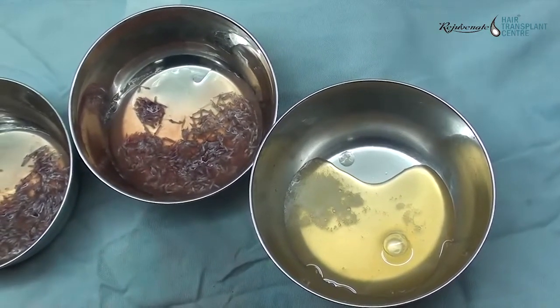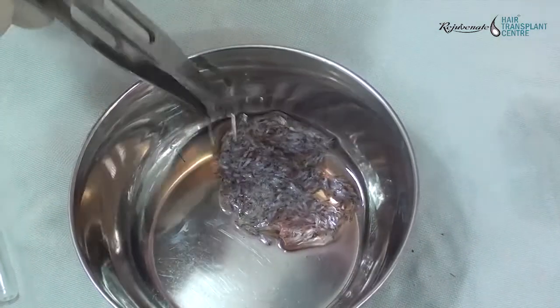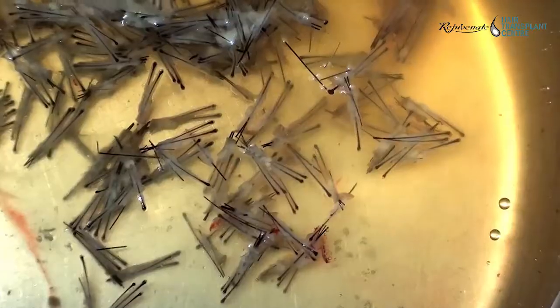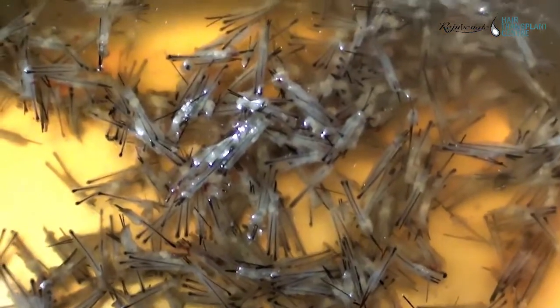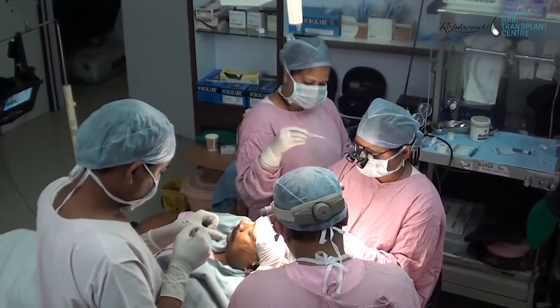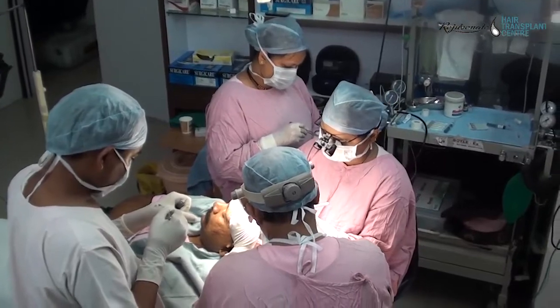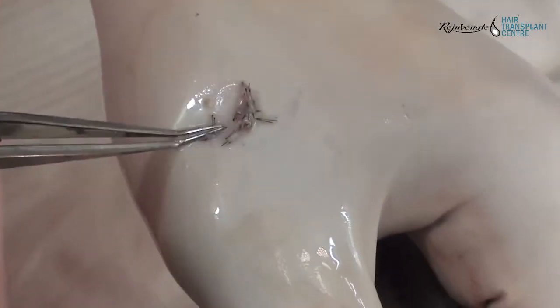This is the plasma, and the grafts in another bowl are submerged in plasma. When plasma comes into contact with the follicles, it forms a gel. The grafts form a clump, or some may float initially.